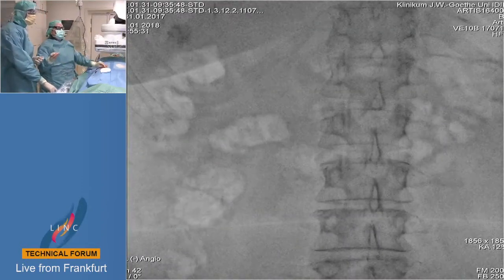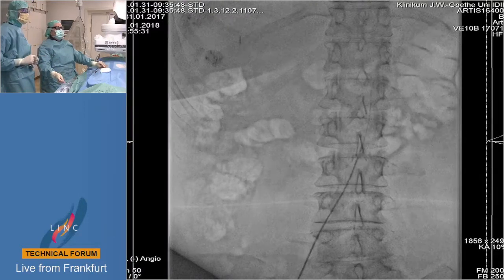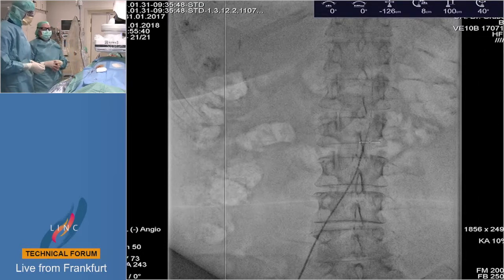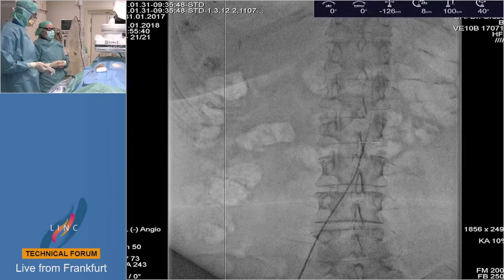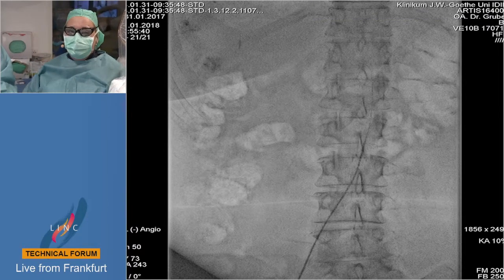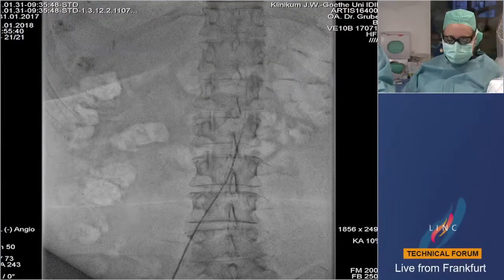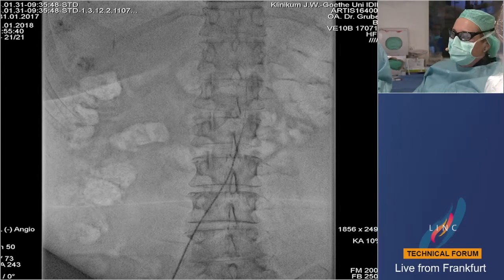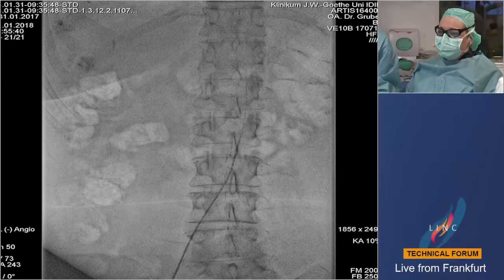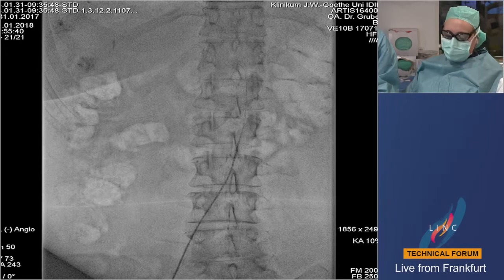Could you comment whether or not this patient has been treated before, or whether this is the first treatment for this patient? Yes. This is the second TACE of the liver lesions. The first TACE the patient had in December last year. In the medical history, the patient had liver cirrhosis because of hepatitis B, type 2 diabetes mellitus, and hypertension.